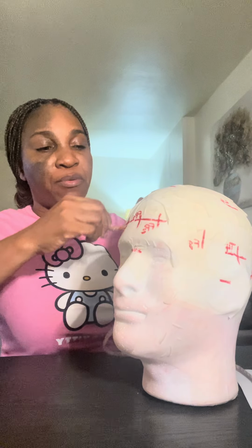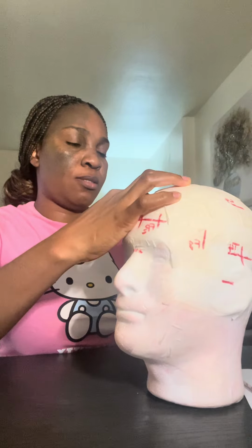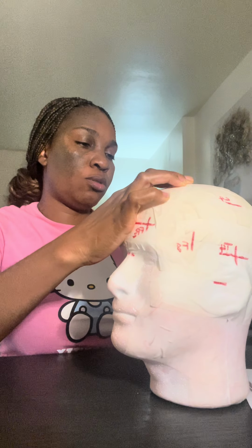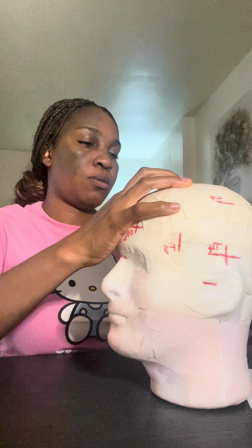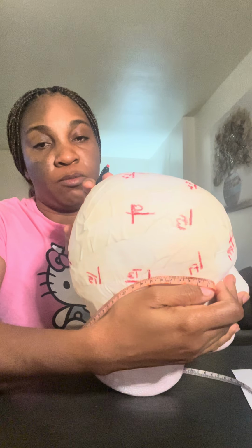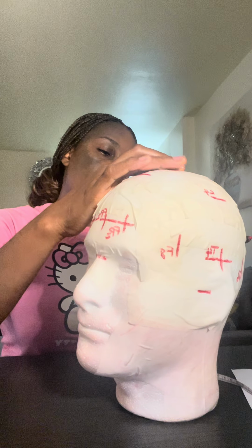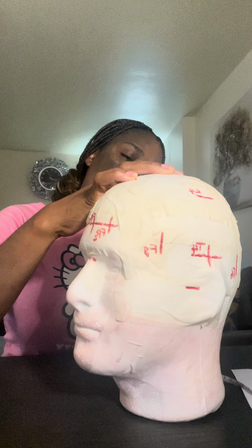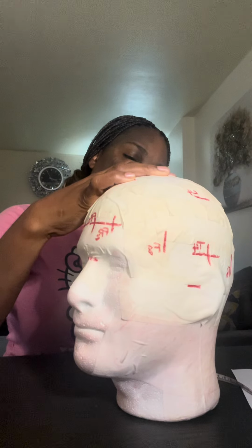Okay, that's my F3. Now from my F3, going back 6, this gives me my true C3. Okay, yeah, that's my true C3. From my true C3 going to O1, 6. This is my P3.